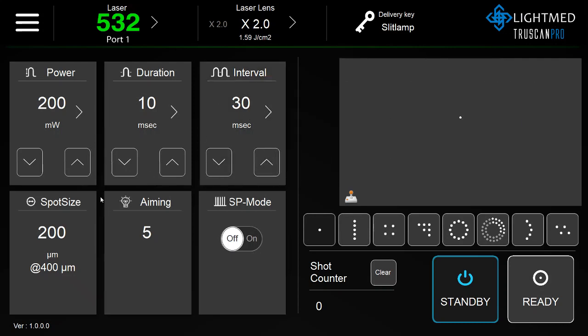In order to adjust the spot size, you use the knob directly located on the slit lamp itself. You will see it adjusted here on the graphic user interface.